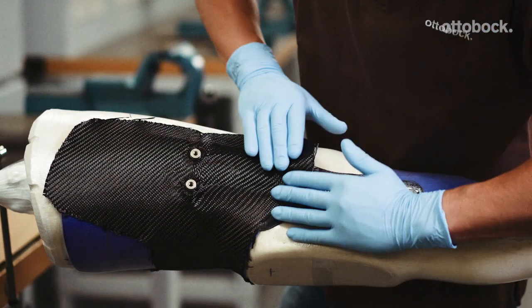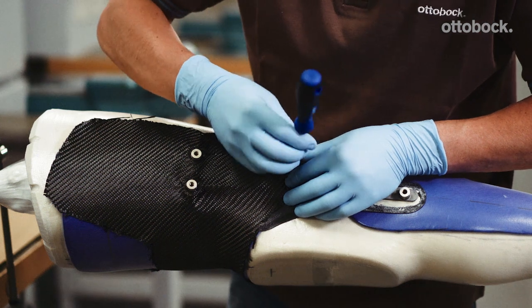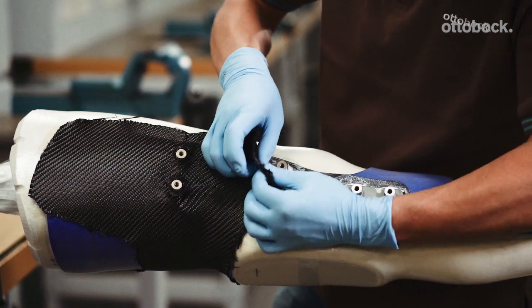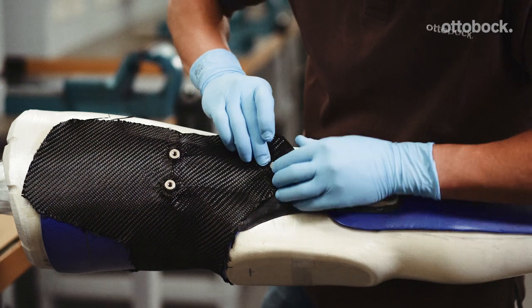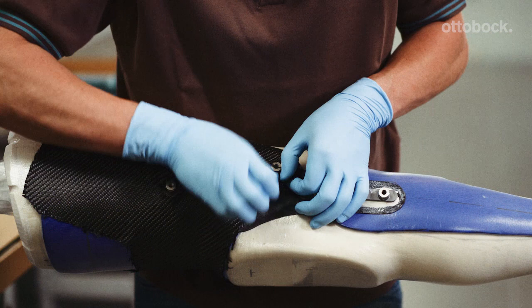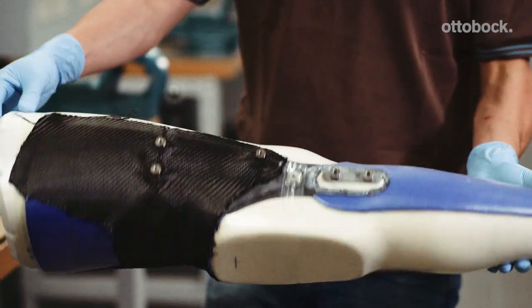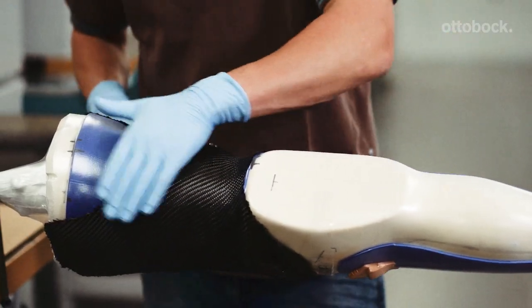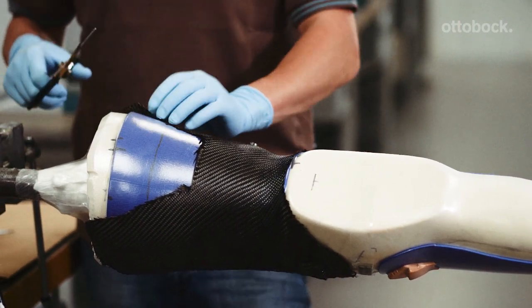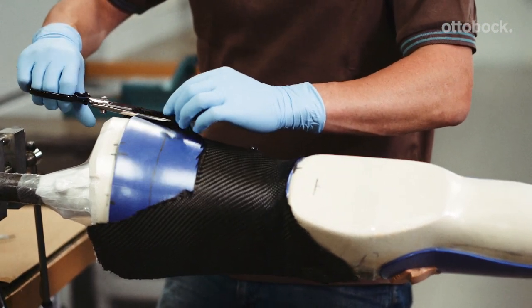Push the fabric to the side to expose the anchor nuts. The carbon fabric in all the thigh layers must be cut back to the marker for the flexible posterior soft surface. A flexible strap is applied in this example.